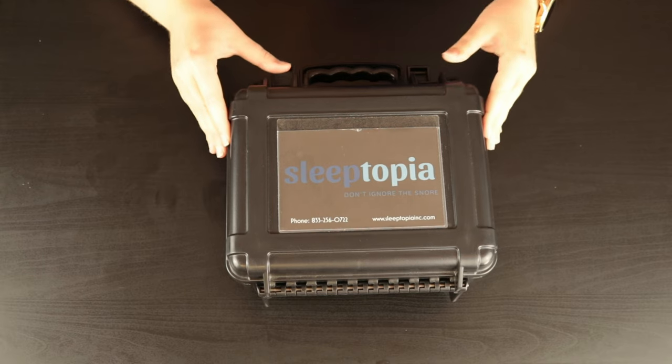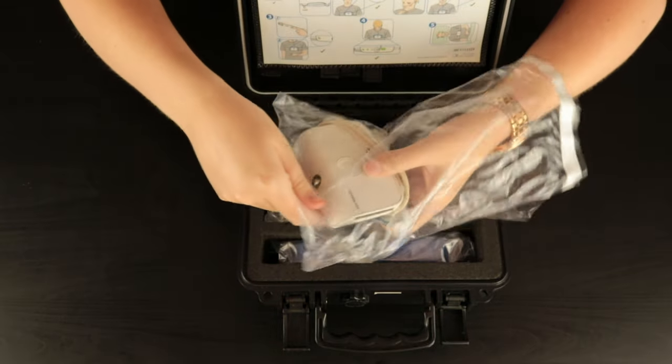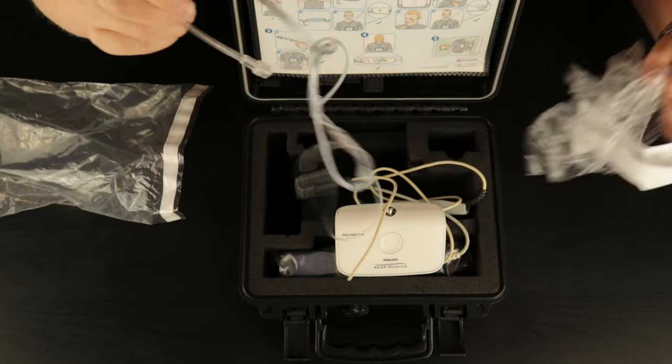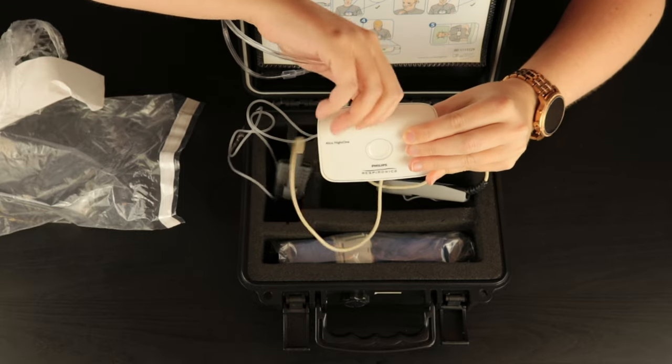Now we're going to show you how to put the device on. The first thing you'll want to do is open up the case. Next, take everything out of the box. Then you'll want to open the nasal cannula packaging, because we use sterilized and fresh ones every time. Connect the nasal cannula to the Alice device using a twisting motion.